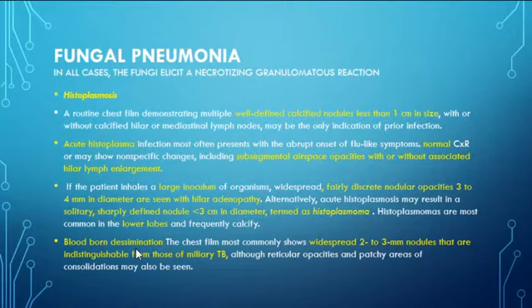Okay. Now, fungal pneumonia. In all cases, the fungi elicit a necrotizing granulomatous reaction. Histoplasmosis: a routine chest film demonstrates multiple, well-defined calcified nodules less than 1 centimeter in size, with or without calcified hilar or mediastinal lymph nodes. This may be the only indication of prior infection.